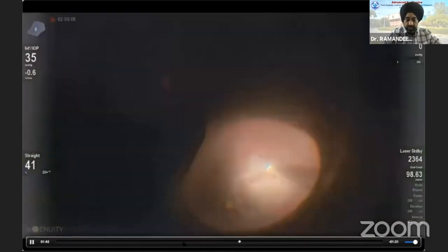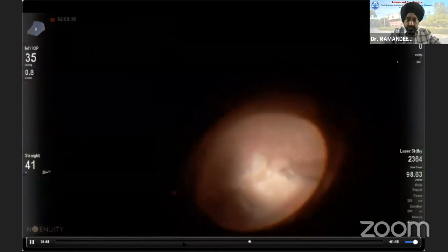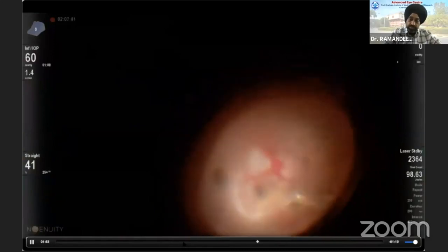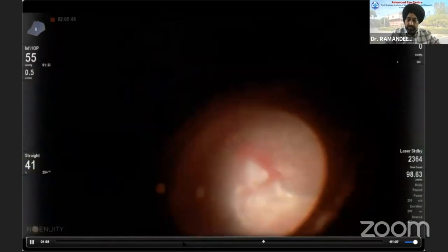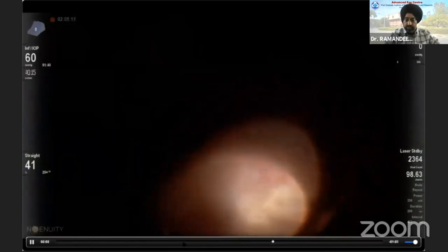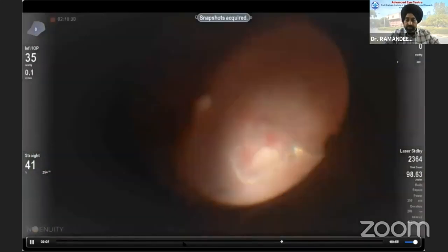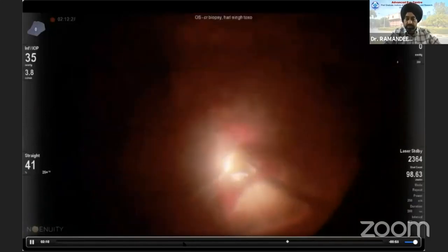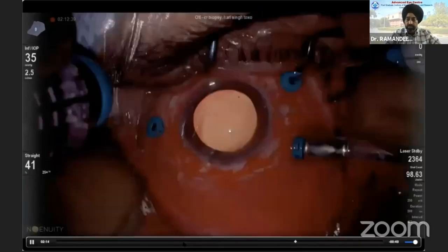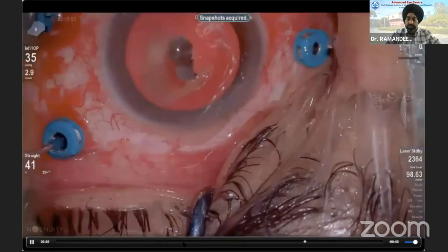Once you see a whiteness of the sclera, you know you are in the right plane. Then you just have to feel the toughness of sclera and keep cutting with the vertical scissor. Some bleeding will occur, but you have to take care with the bottle height. Retina and the choroid sometimes separate from each other. You have to make sure that the vitreous has been completely removed so that it doesn't happen. Once they are separated, you have to take it out with the appropriate forceps through a large wound, and then it is handled for the sampling and for the preservation, as done in this patient.